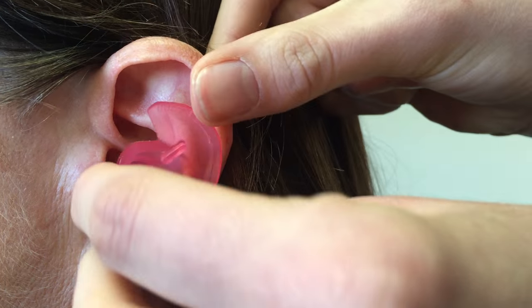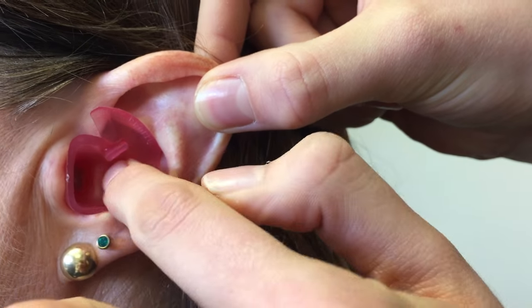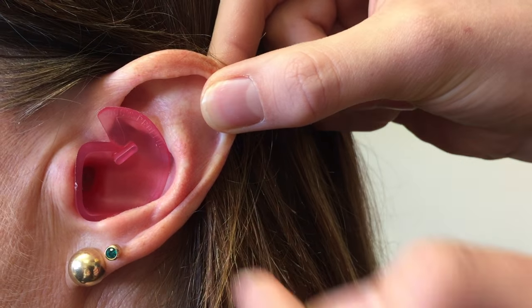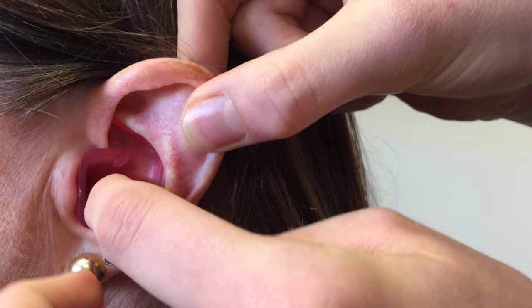To make a good fit, the pointy bit goes in first — we're working from the bottom up. Use your finger to push it in, just like that. Then we use the top bit here, and flick it under the curves of the ear to hold it in place.